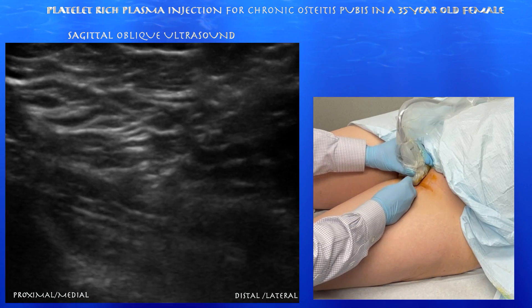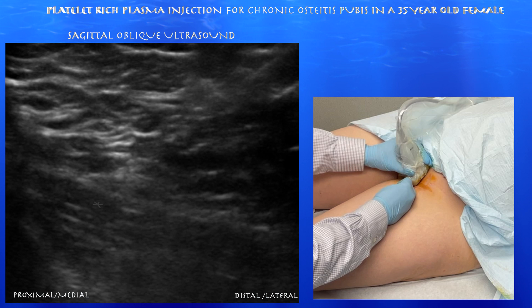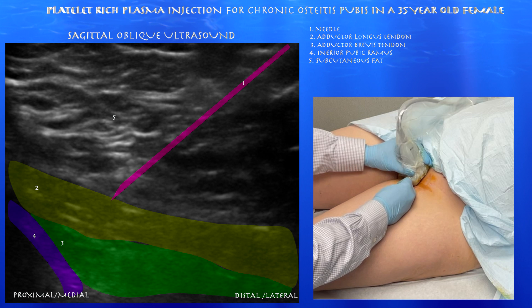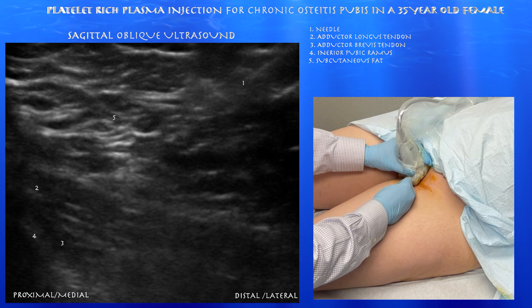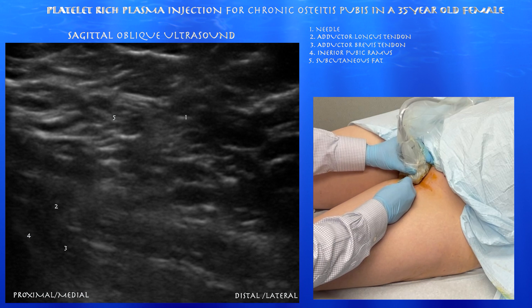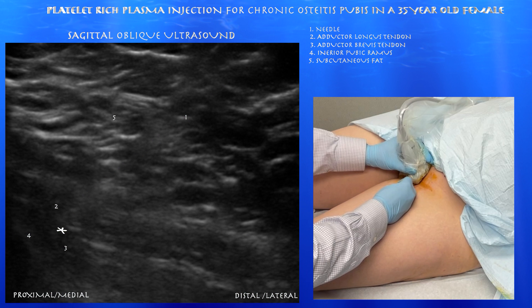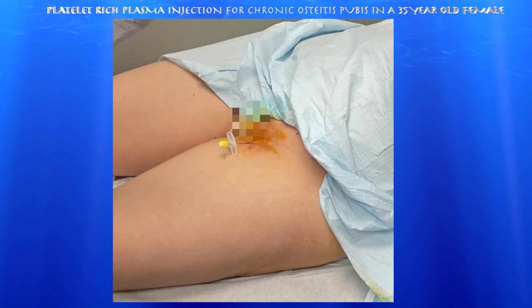The needle is starting to enter into the proximal aspect of the adductor longus, perhaps in the tendon, just near the inferior pubic ramus. The needle tip is just superficial to the tendon at this point. We're continuing to advance the needle, and there appears to be some flexibility within this tendon and muscle, as the needle is essentially pushing that tendon and muscle downwards.